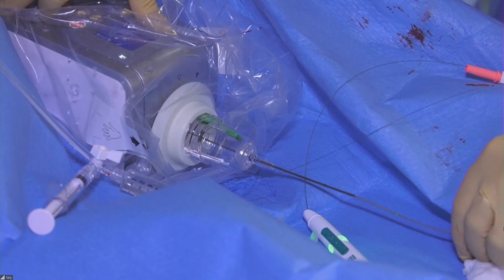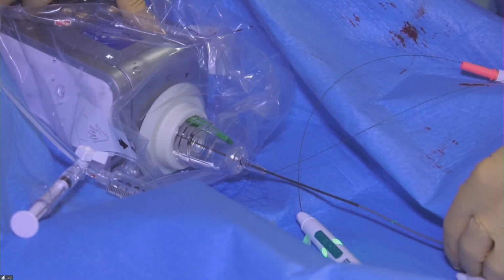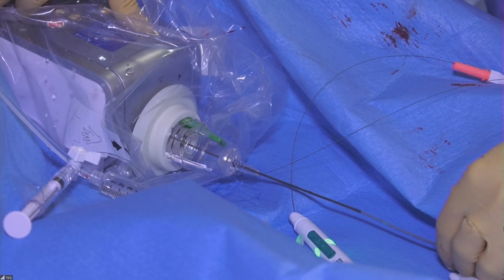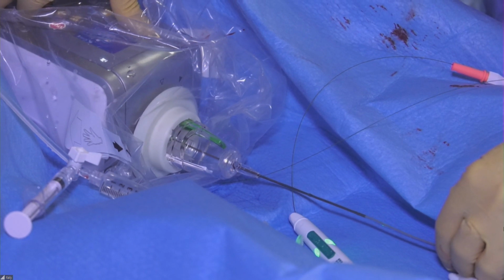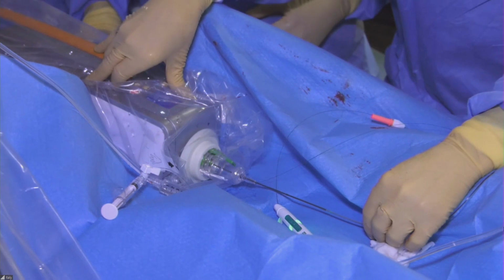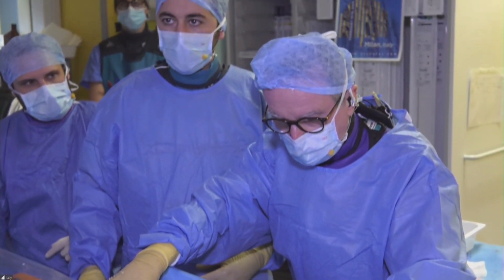So in the meantime, Antonio, you said that this patient is in a trial. So does the trial mandate, let's say, a target final pressure measurement? No, the trial does not demand FFR measurement at the end.